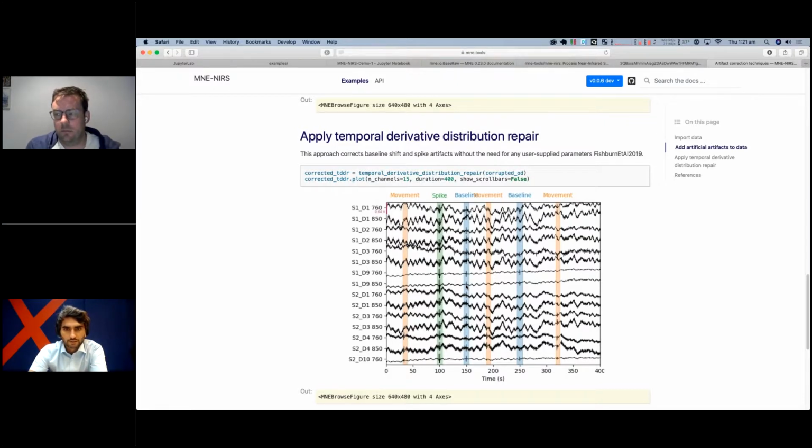Okay, let's take one specific question. Maybe this will help them to use the toolbox properly. I have a question regarding the 0.0.5 version of MNE. I try to read data from a NIRSport 2 device. The code in your GitHub seems to support this, but the code from the pip wheel doesn't. Can you say when the wheel will be updated?